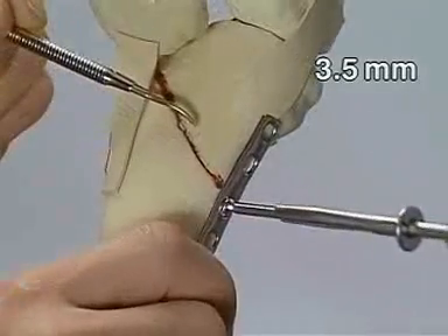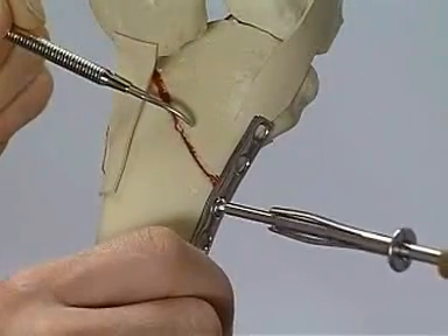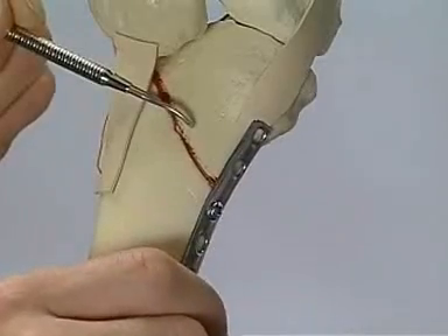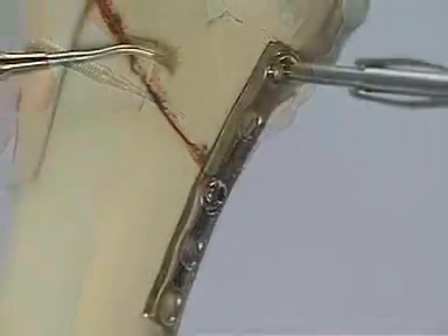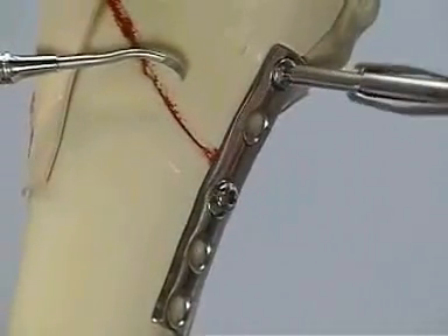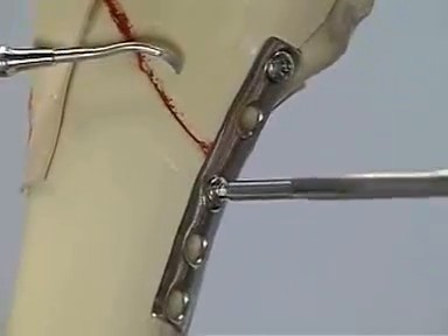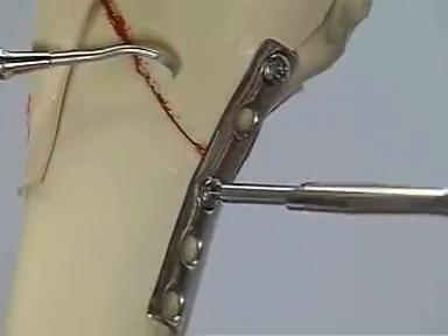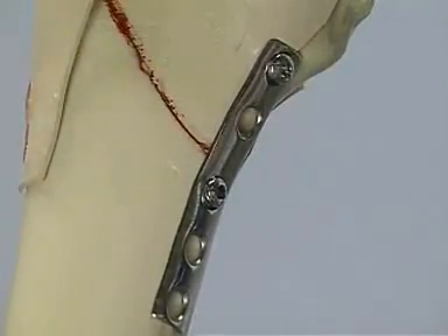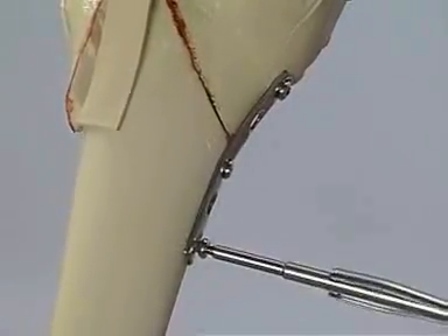This maneuver pushes the plate to its anti-glide or buttress position, thus reducing the fracture indirectly. After placing the most proximal screw, the middle screw has to be re-tightened. By adding the most distal screw, the medial fixation can be concluded.